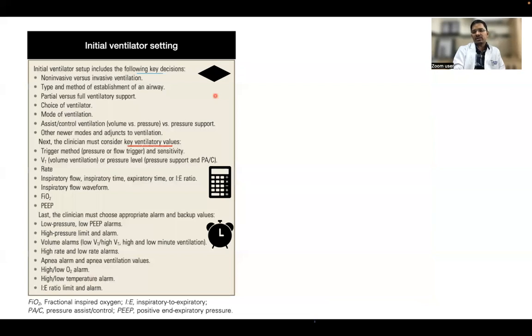How will you start the ventilator? The next question will come, how will you start the ventilator? Before you start the ventilator, we should understand a few important points. Before we start, we should understand whether we need invasive or non-invasive ventilation. We need full support or partial support. What type of mode we want to start, which type of ventilator we start, because there are advanced modes of ventilation also.